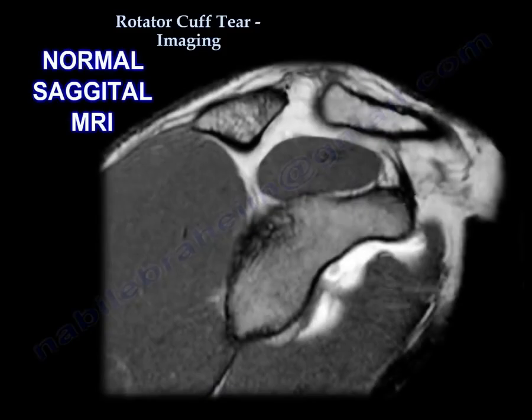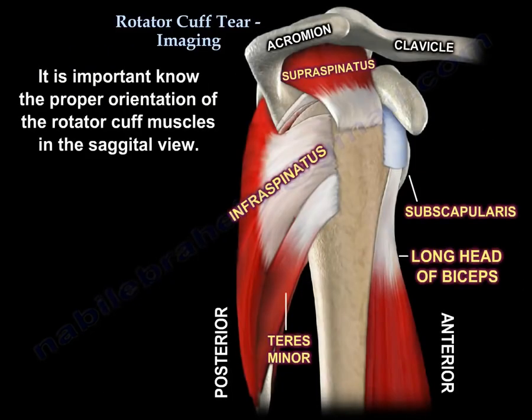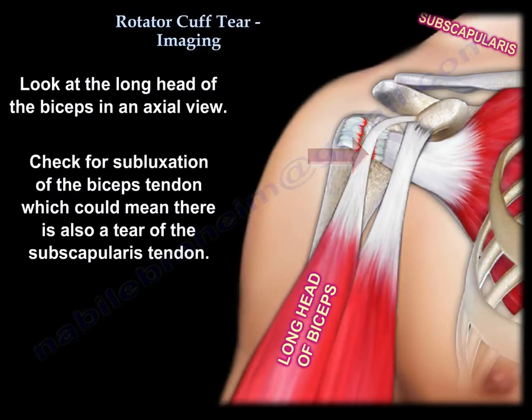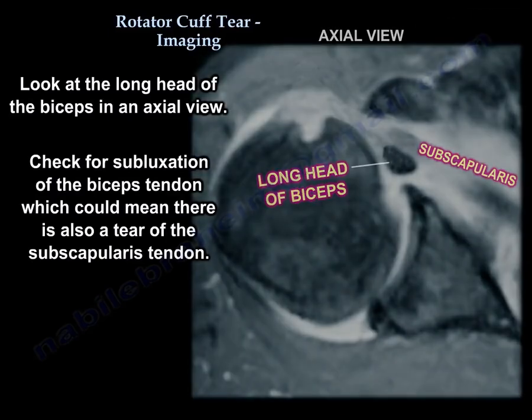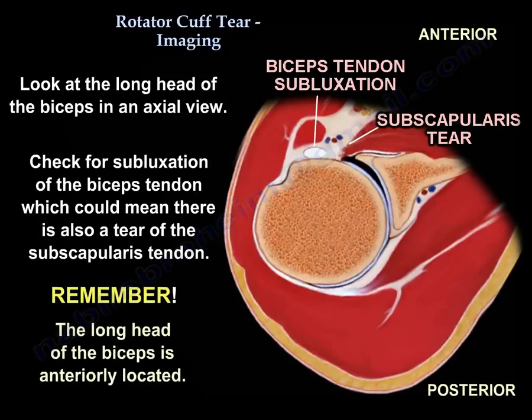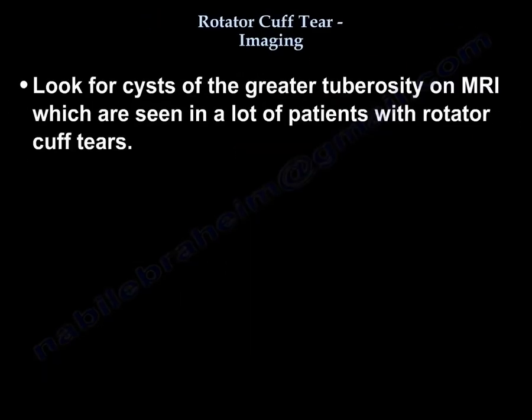It is important to know the location of the muscles in the sagittal view with proper orientation. In the sagittal view, you need to locate the supraspinatus and subscapularis on one side, and the infraspinatus and teres minor on the other side. Then look at the biceps — usually in an axial cut — to see if there is any subluxation of the biceps, which could indicate a subscapularis tear, especially of the superior part. Remember, the biceps is anteriorly located. Also, look for cysts on the greater tuberosity on MRI, which are seen in many patients with rotator cuff tear.